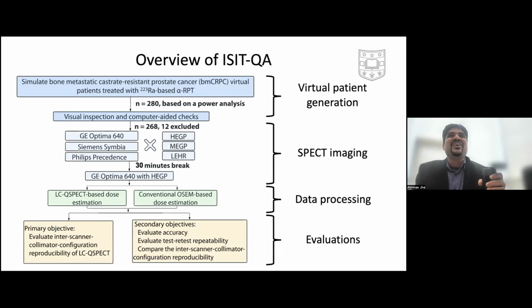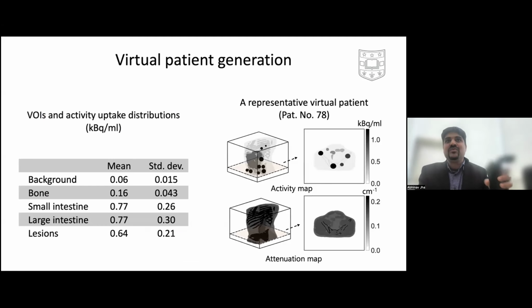So now comes the second part, the doing. The background, everything is constant, but the tumors you're varying. Yeah, the tumors I'm varying. The anatomy is varying. The uptake in the different physiological regions has different standard deviations. This is like you're assuming a Gaussian distribution, and you randomly sample. Yes, we randomly sample.